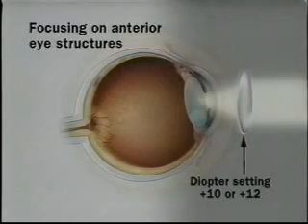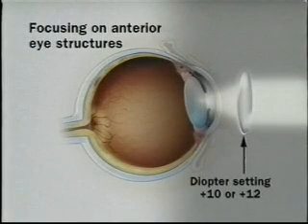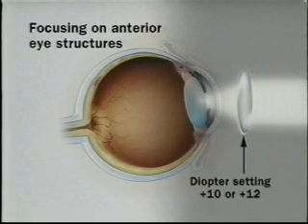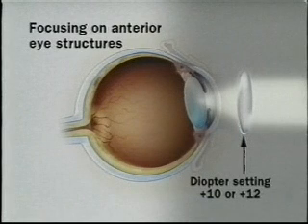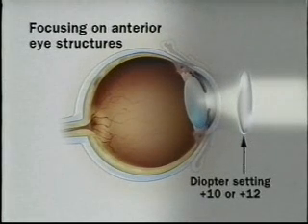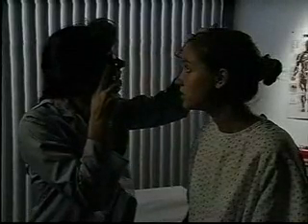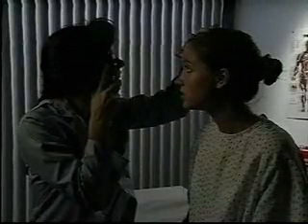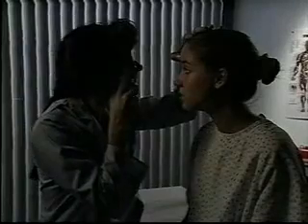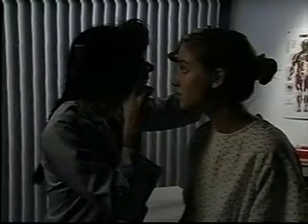To focus on more anterior structures, such as opacities in the vitreous or lens, change the diopter on the ophthalmoscope to more positive numbers, such as plus 10 or plus 12. Repeat the ophthalmoscopic examination on the patient's right eye using your right hand and right eye.